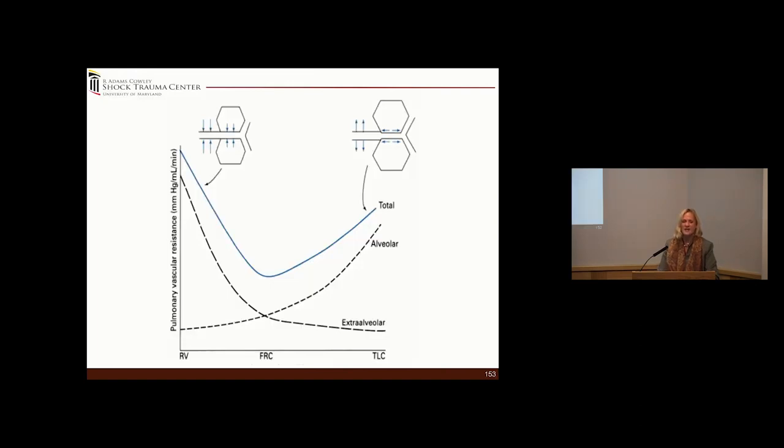But why does that not increase right heart strain? Well, as we know, at residual lung volume and TLC, you are at your highest pulmonary vascular resistance, but at FRC, you are at your lowest. So we took her from residual lung volume to FRC. Of course, if we put anybody in here on an airway pressure of even 20, you're going to be at TLC.